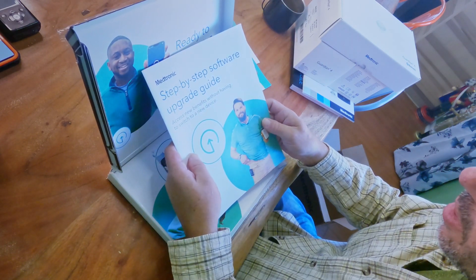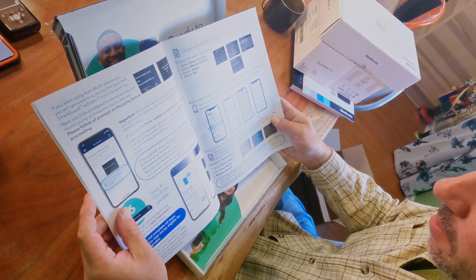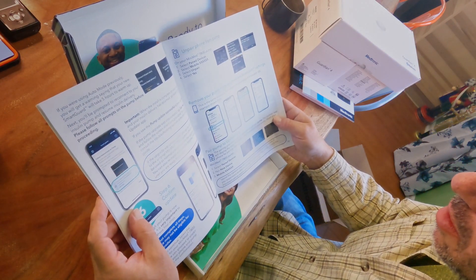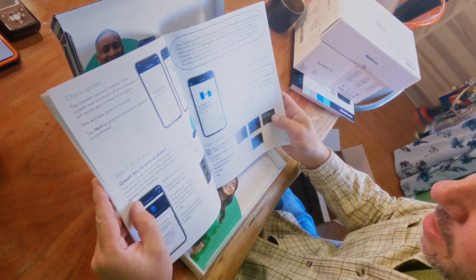There's also a step-by-step software upgrade guide. You can also just watch the video — I believe it will do everything that we just did. I was looking for this earlier but I didn't find it.